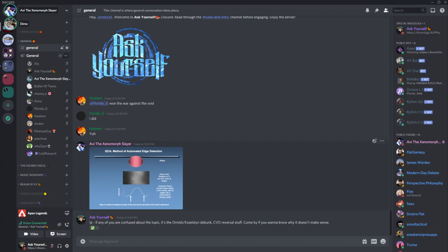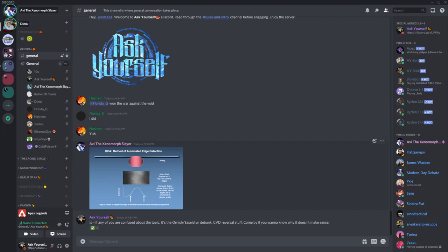And you can have certain automated consistent programs that can delineate where it would consider the best guess for brightness and darkness to where the artery edges. But it's really not something that is sharply demarcated. Just to give you examples, in some cases it could be a pixel length, depending on the caliber of the artery. So here's an example of that.